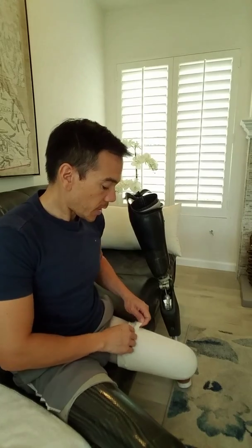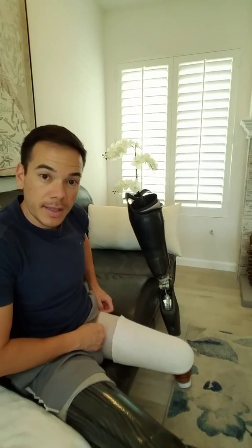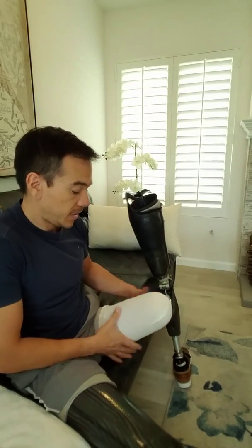If I gain too much weight, then I need a new socket completely. I actually had both of these sockets made earlier in the year just because I gained weight from going to the gym every day. To continue, I'll take off two socks, leave one sock on so that I can roll the liner back on itself — that'll make it easy for the liner to come off.